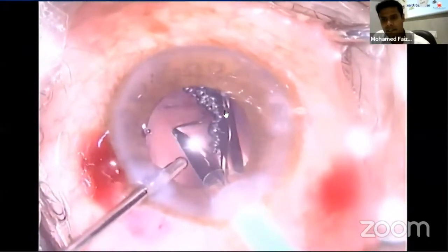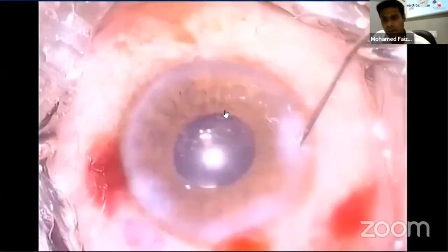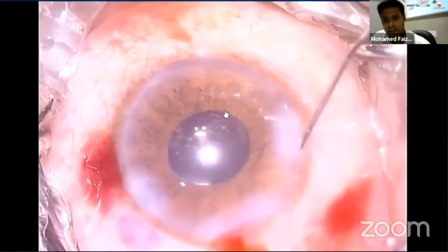In this case, as the pupil is of average size, I didn't go for a pupil expander, iris retractor, or anything like that. And the case went very well.